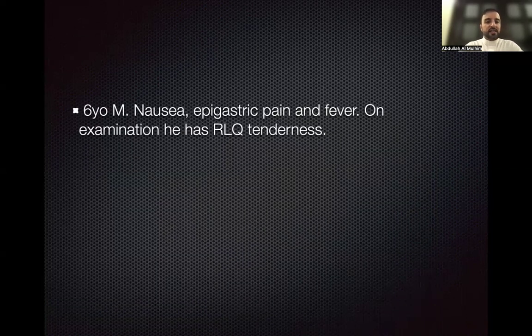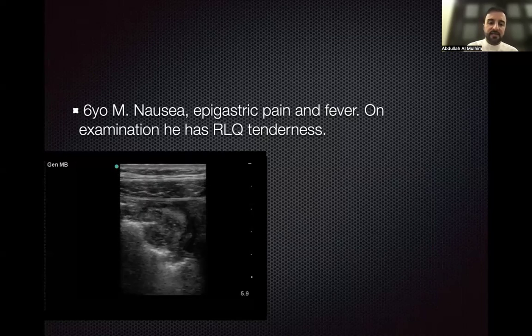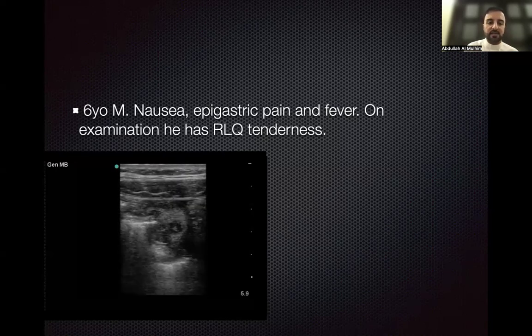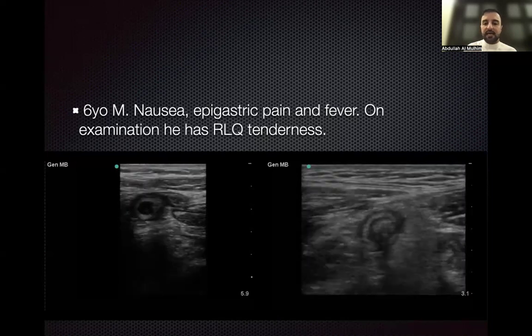So moving to this case, which is very common that we are seeing, especially in pediatrics, somebody who's coming with abdominal pain, you don't know what's going on, and during your exam you saw there is tenderness in the right lower quadrant. We know that we are not preferring to go for a CT scan for this patient, and you tried to go for an ultrasound, and unfortunately they told you it will take at least 2-3 hours to do a comprehensive ultrasound. You put the probe in, and you saw that this patient is having an appendicitis, which is very typical, a blind-ended loop with all signs of appendicitis. So you call the surgeon, and this patient can be taken to OR immediately if all the setup is ready.